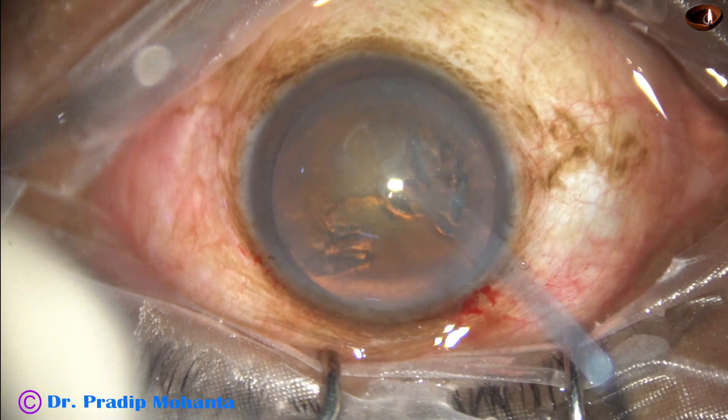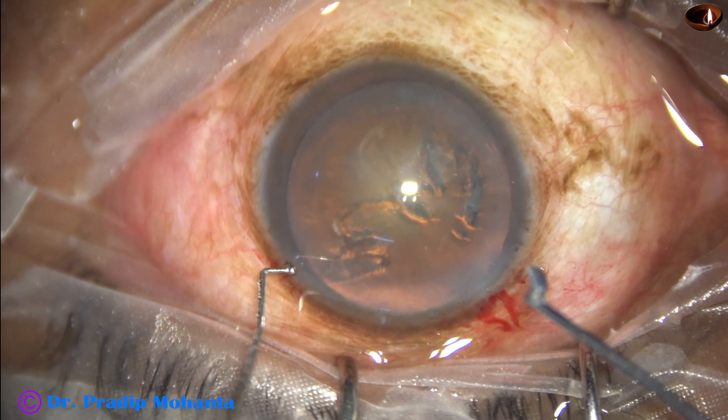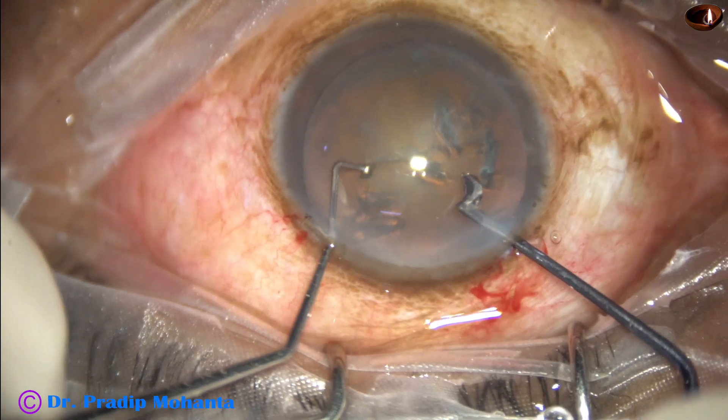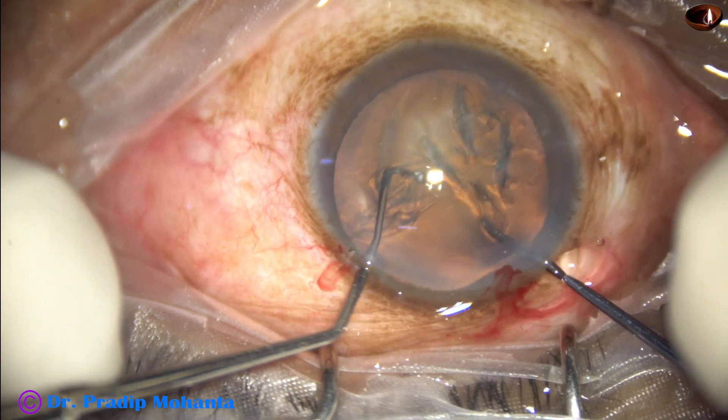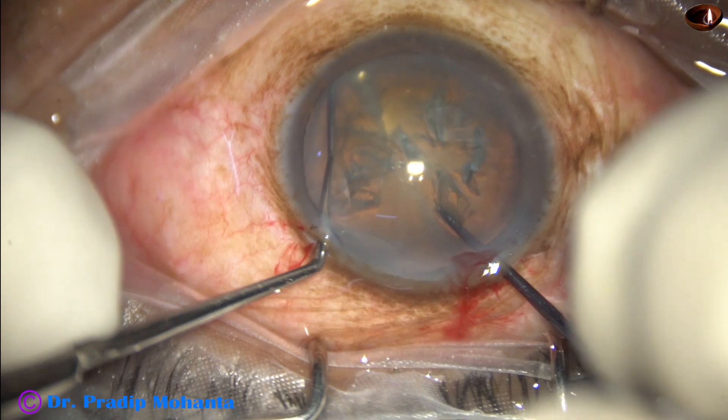Now let us see this in slow motion. After injecting visco, the sustainer goes in first, then the pre-chopper. The pre-chopper is placed just in front of the main incision, just beyond the rhexis.